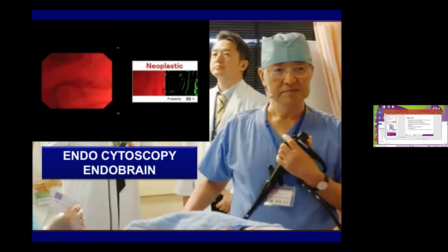We have started recently doing a study with EndoBrain, which is actually an artificial intelligence added to an endocytoscope, and it's quite remarkable how you can use this. And of course, at present, it seems more like a fun toy to use, but I think more and more as we start using it, it's going to become an important tool in future, so that even a novice endoscopist can be as expert as Professor Teoh in telling you whether you're dealing with a JNET type 1 or type 2A or type 2B lesion, so that you can then try and resect these lesions based on that.